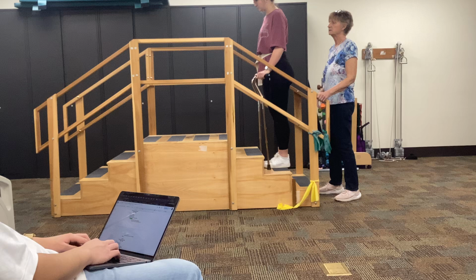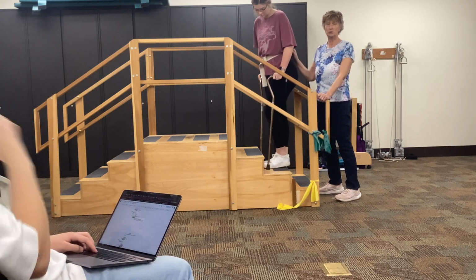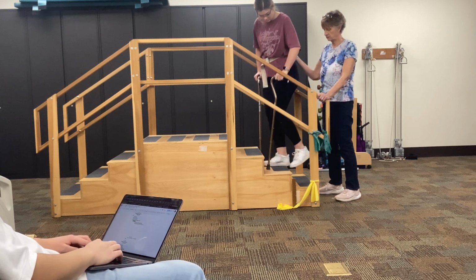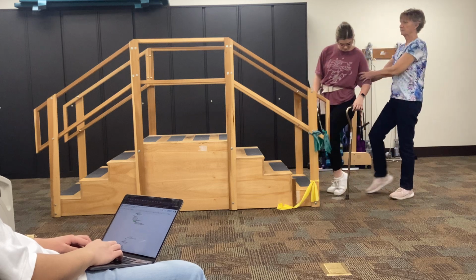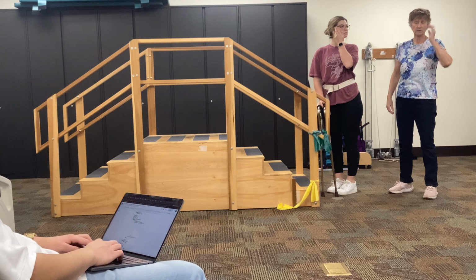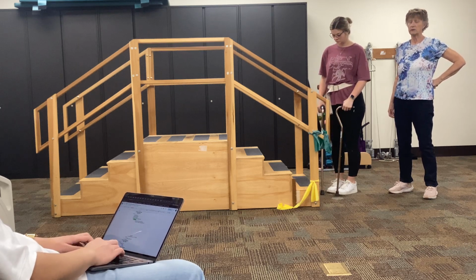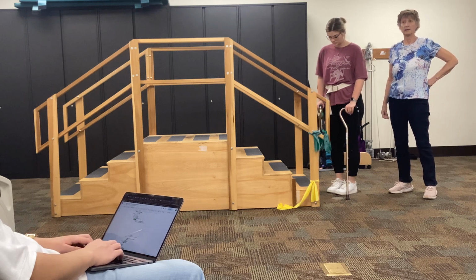Okay, so no, because that really basically is the 2-point gait on the stairs. So you can turn around and come on back down. Sorry. For the 4-point gait, there really is no progression on the stairs, and the safest way for them to do it is to revert to the 3-point gait.